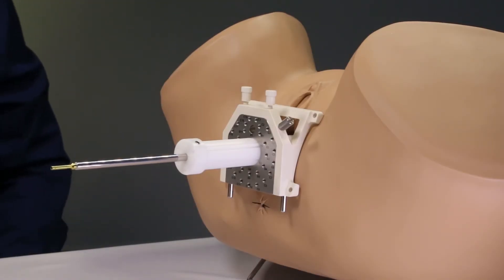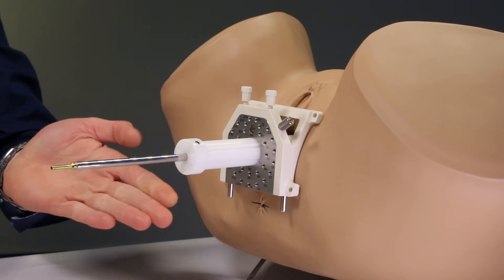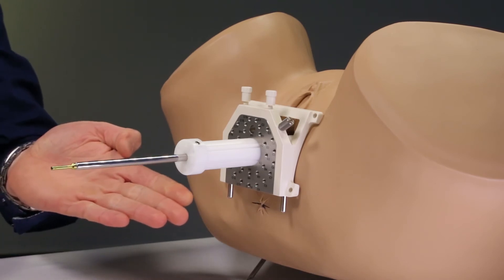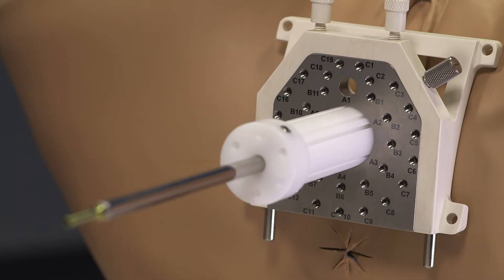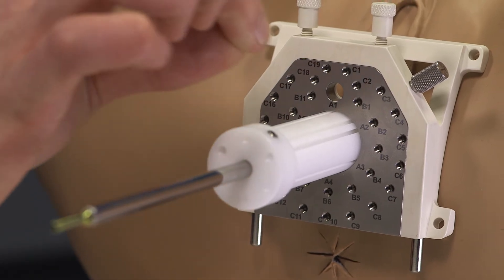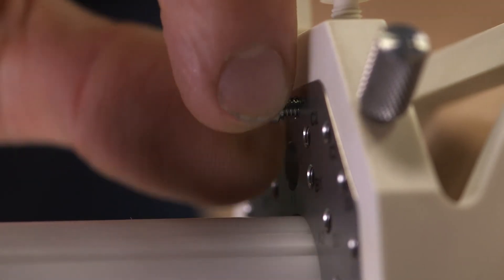At this point we are ready to connect the template to the patient by using the four suture holes of the template, but this is not required. Prior to the insertion of the interstitial needles we can screw in the needle collets.